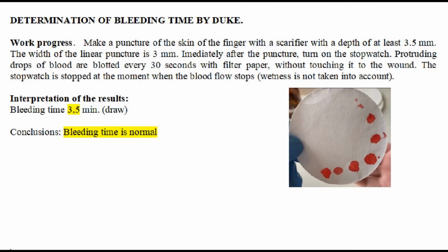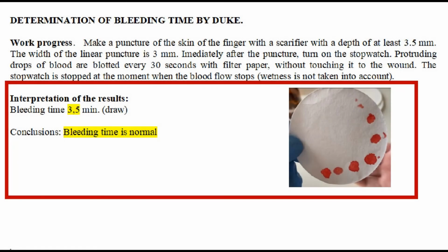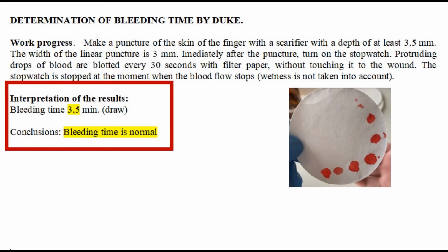We will enter the received data into the protocol. To do this, you need to sketch and write down the results obtained. Draw a conclusion. The bleeding time was 3.5 minutes, which is normal.